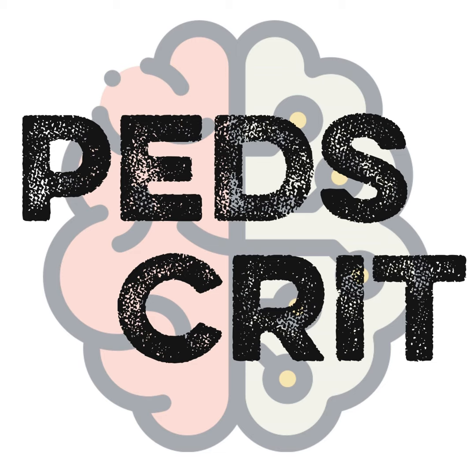There is an additional cannula that sits in the LA appendage or left atrium. There are multiple ways to do that, but most of them do get it, at least in our practice has been that way. But the rest of the kids who get peripherally cannulated, we do look for all of these things. And if there is clinical evidence and evidence with the echo, they do get LA decompression. Because there is not a unified consensus, I think it's based on every kid, how they present after the cannulation, would be a fair statement.